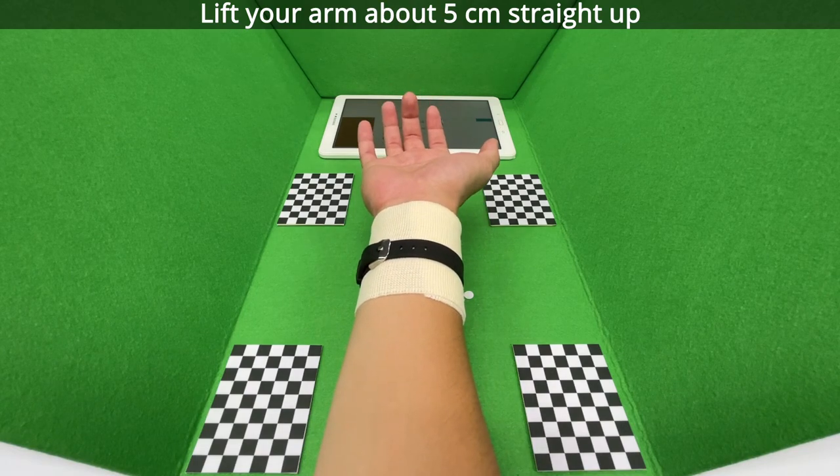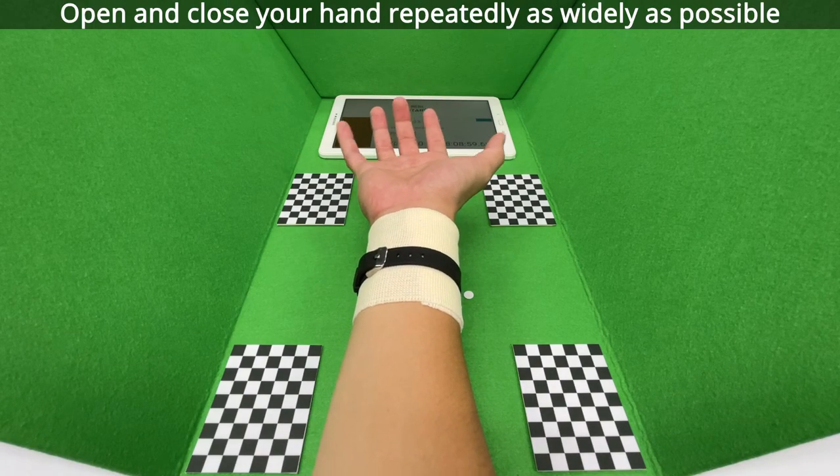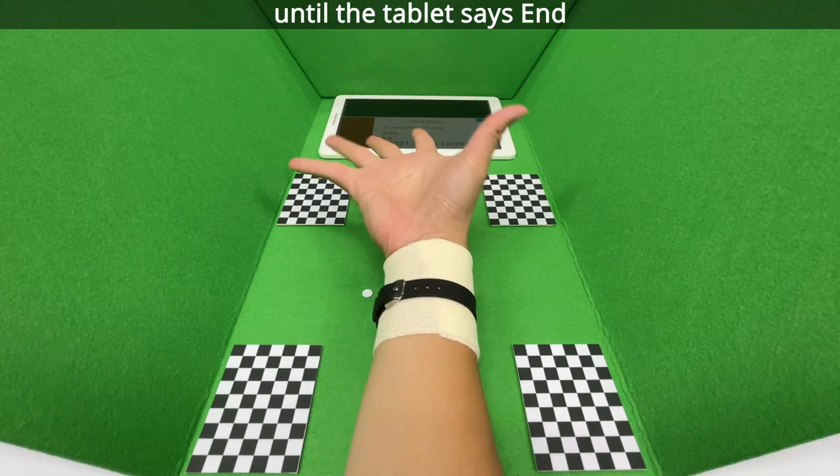Lift your arm about five centimeters straight up. Open and close your hand repeatedly as widely as possible until the tablet says end.